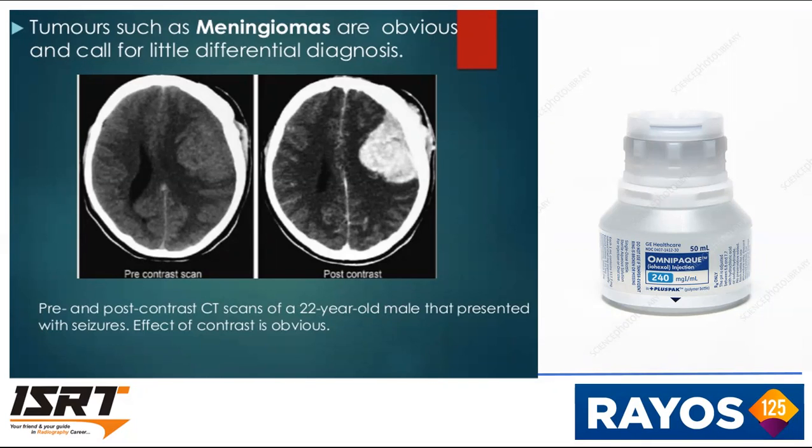That is why they are increasing in size. So tumors are highly vascular, with very different kinds of vascularity. Normally they will be more vascular than normal tissue, hence the contrast is pooled or accumulated in the abnormal tissues.